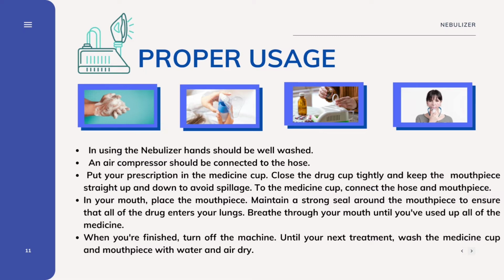Breathe through your mouth until you've used up all of the medicine. And lastly, when you're finished, turn off the machine. Until your next treatment, wash the medicine cup and mouthpiece with water and air dry.